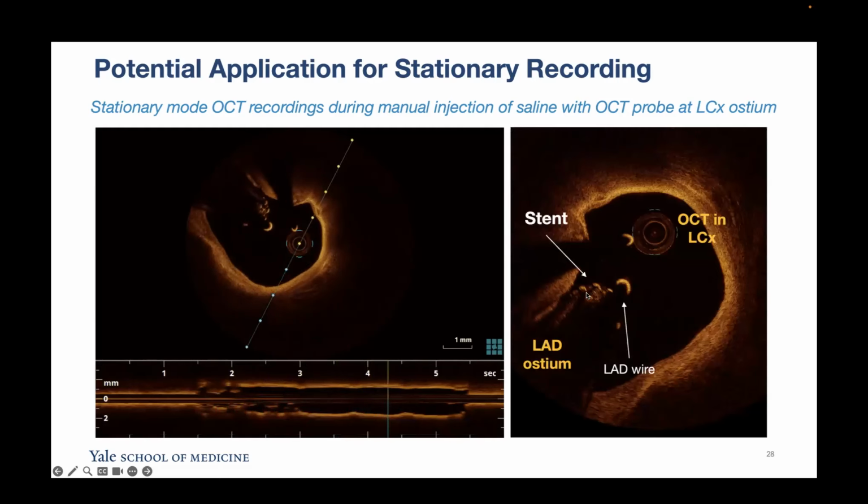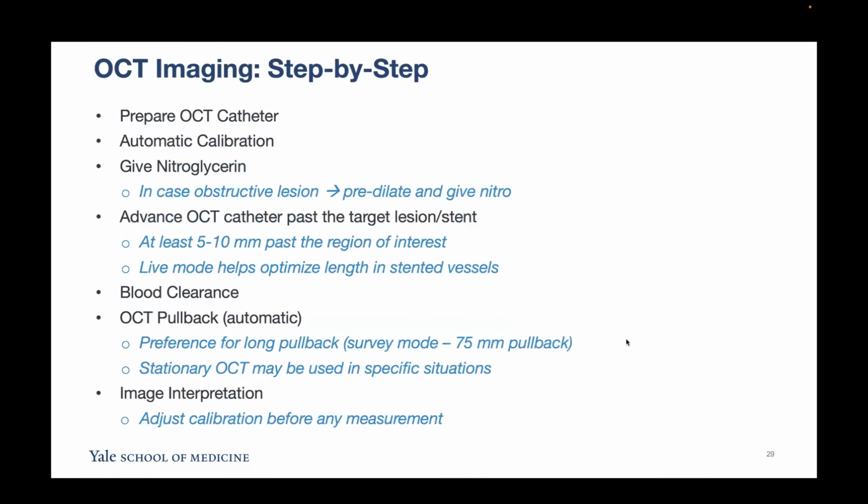And this is just the still picture showing my catheter in the circ. This is the circumflex wire. This is my LAD wire. And this is the stent just aligned at the ostium where I wanted. And then I delivered my stent.